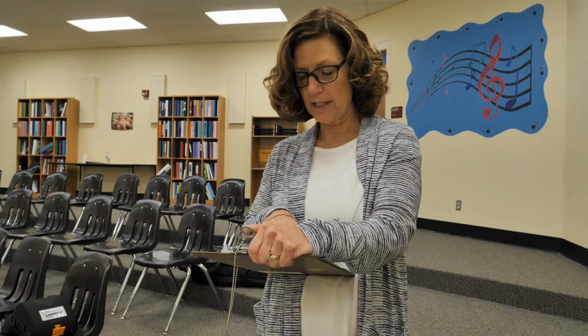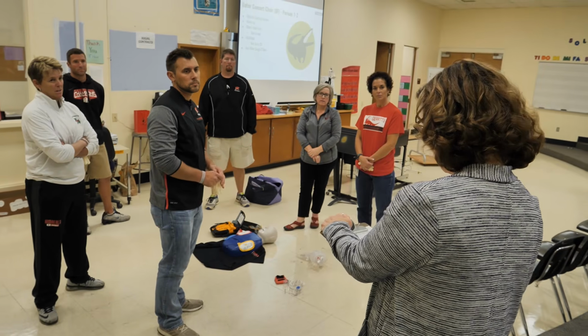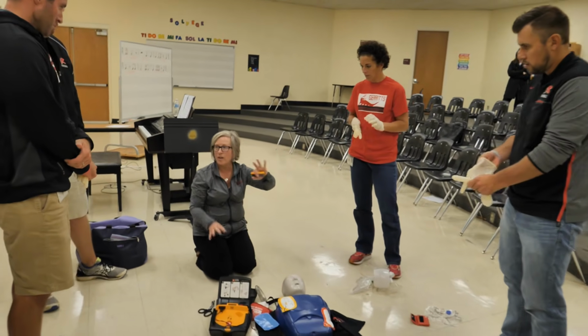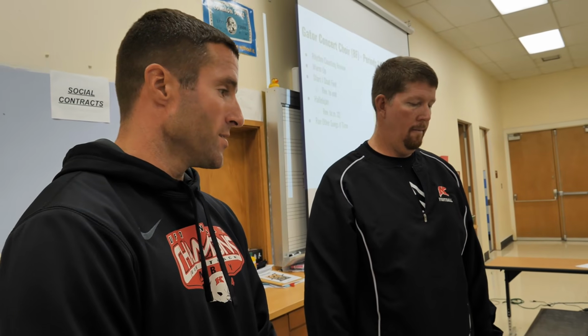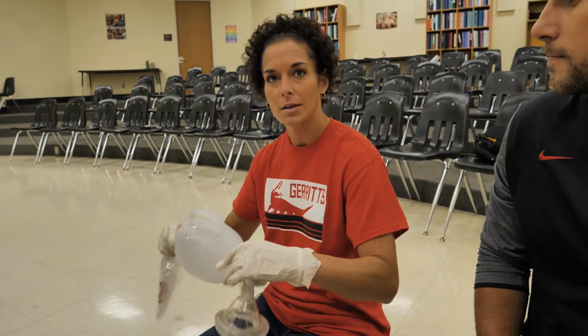Post-drill. Thank everyone for responding. Spend a few minutes reviewing the checklist together, noting times and duration of different steps of the response. Ask the rescuers for feedback and discuss suggestions and concerns. Celebrate what you did right. Consider whether there are any action steps needed. Were there specific communication problems?